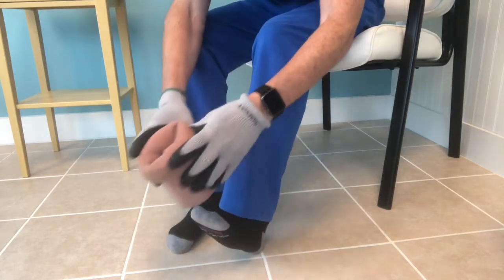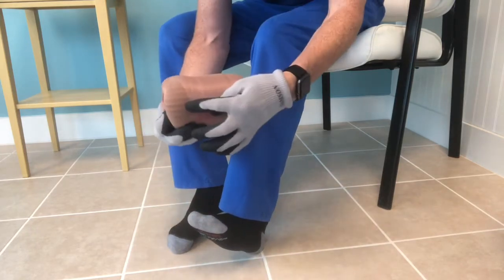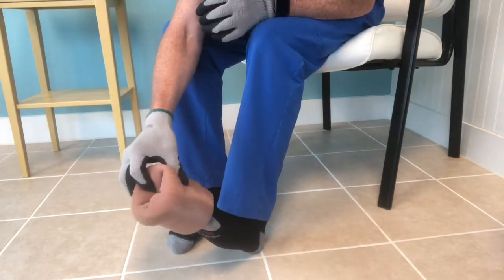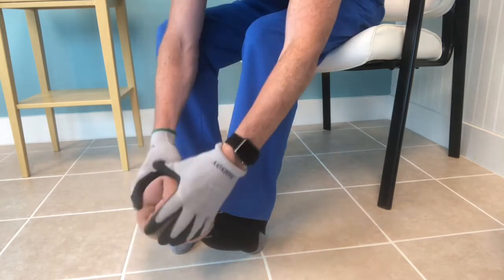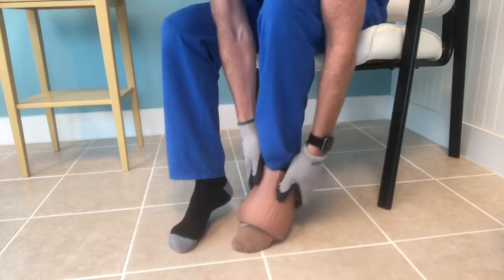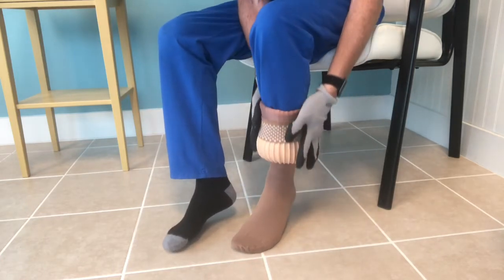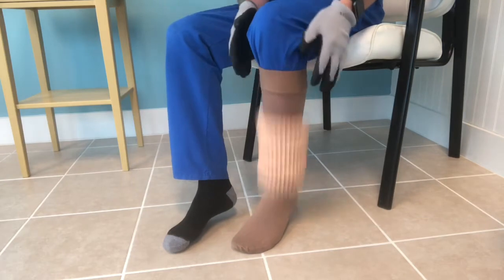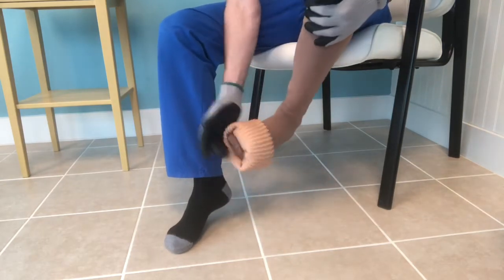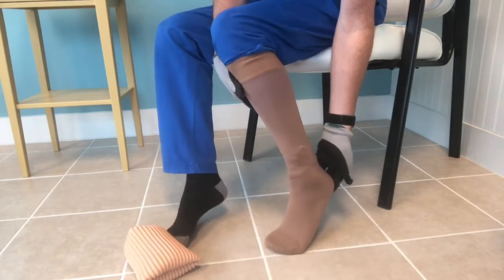Get your rubber gloves on, make sure your toe box is good and tight, make sure you have your heel located in the right position like I just showed there, and roll it on. Use the palm of your hand — don't pinch the Donner, you don't have to use your fingertips — just let the rubber of the gloves do the work and then you do your final adjusting.